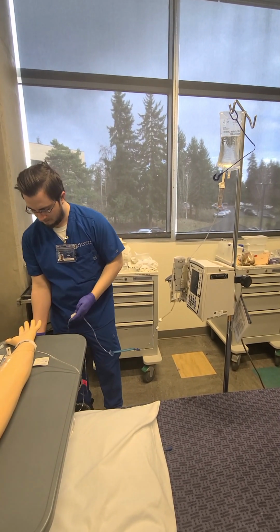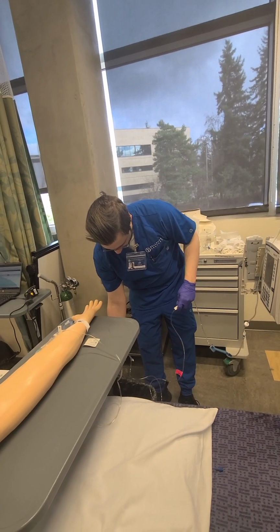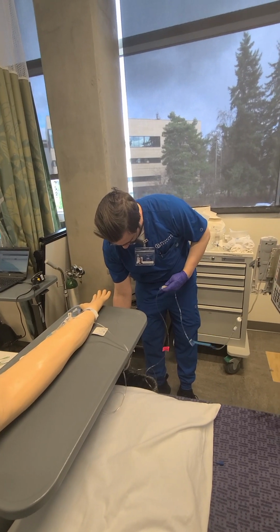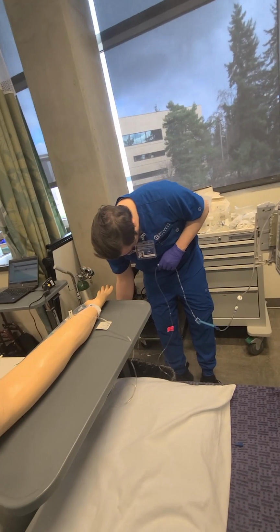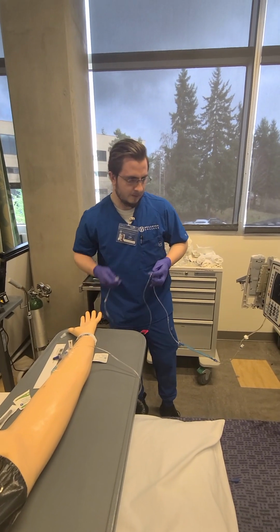I'm gonna take the rest of my medications and we'll also grab primary, secondary tubing, as well as some saline flushes. Looking for any air bubbles or big air pockets in my line, and I don't see any, so I'm gonna call that good.